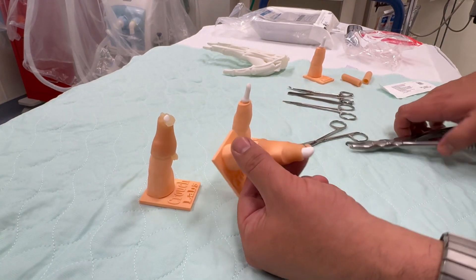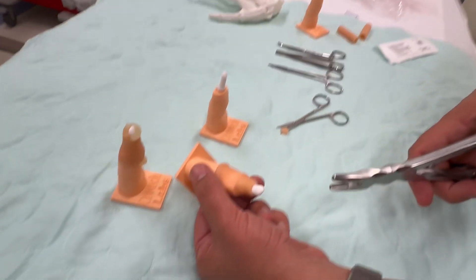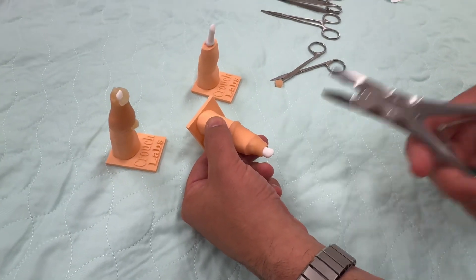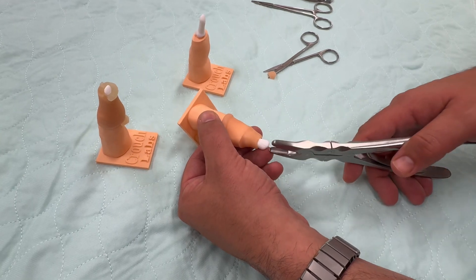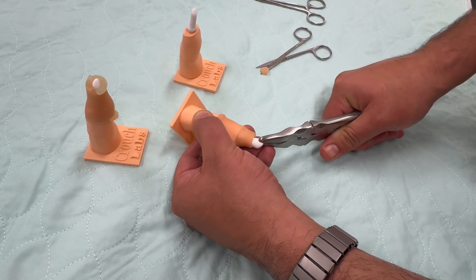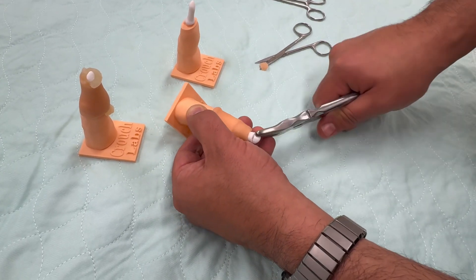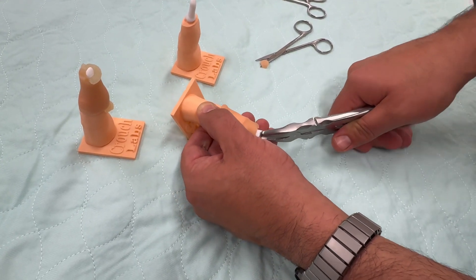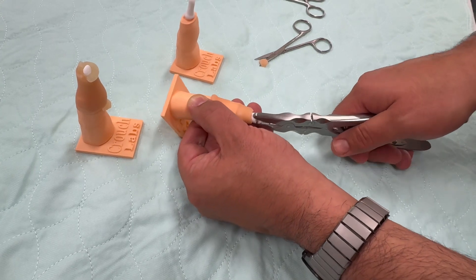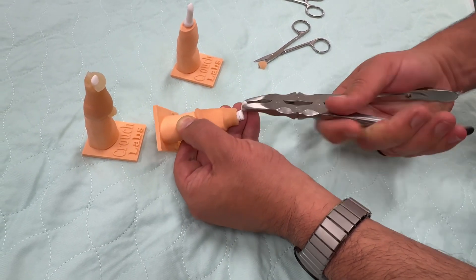These models are designed using PLA with a 20% infill to give a very accurate feel to bone. The hardness of the plastic feels very similar to grinding bone, so as you can see you can take the rongeur and applying pressure it'll give you a sense of crunching and indenting the bone, as well as breaking and removing it in order to grind the bone back so that the soft tissues can be closed over it.